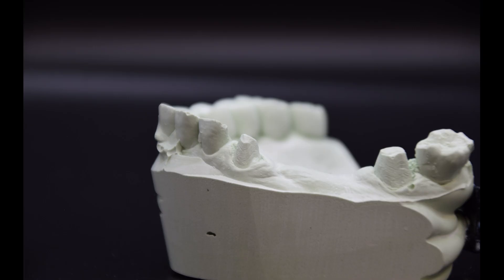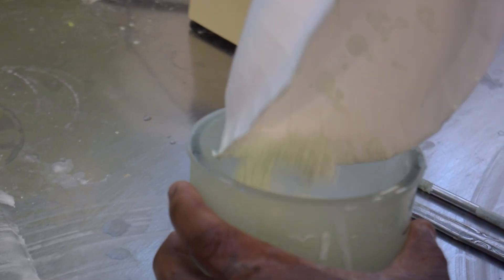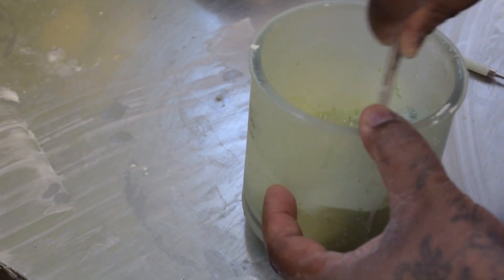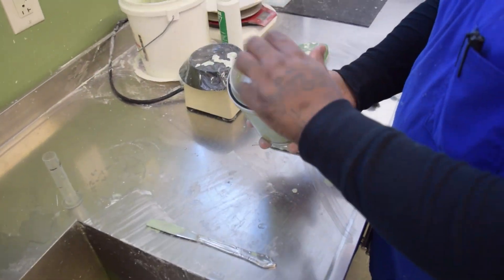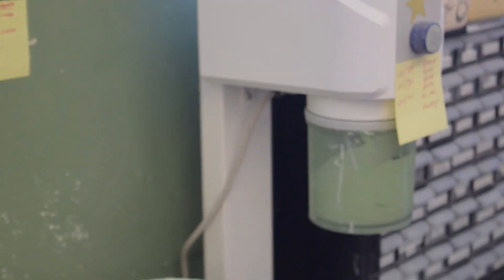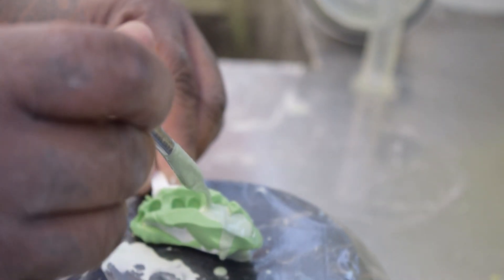The initial step in any dental restoration, stone models must first be made to replicate the patient's mouth. The stone powder is mixed with water to create a slurry and a lab technician carefully fills the impression.